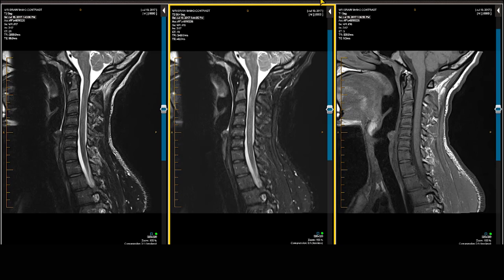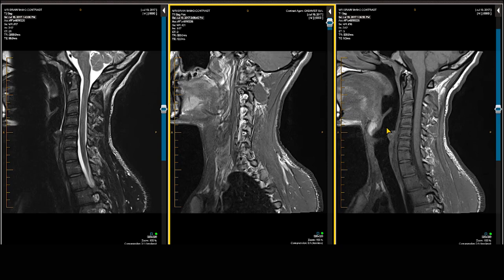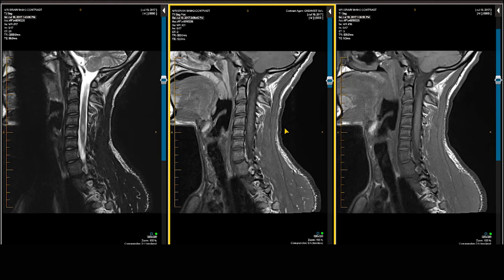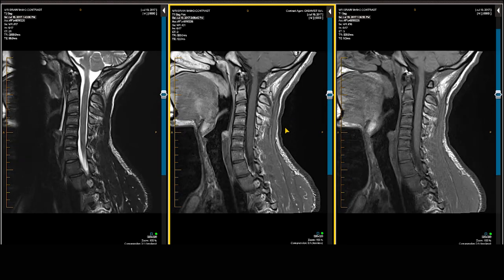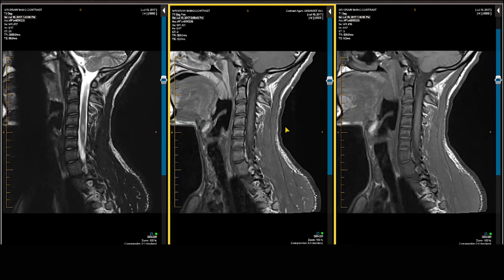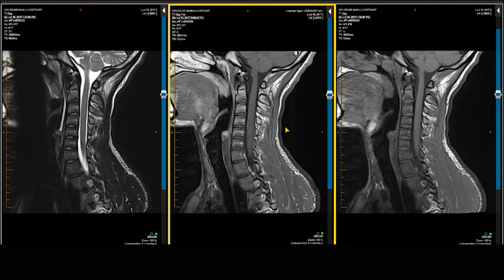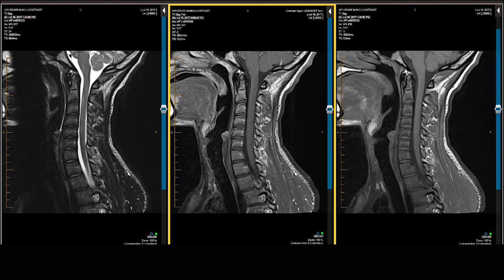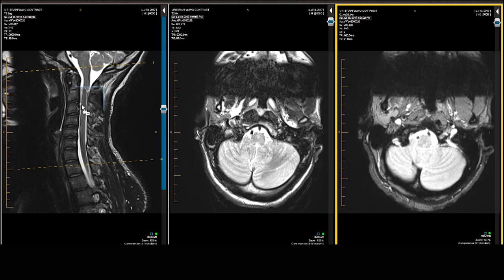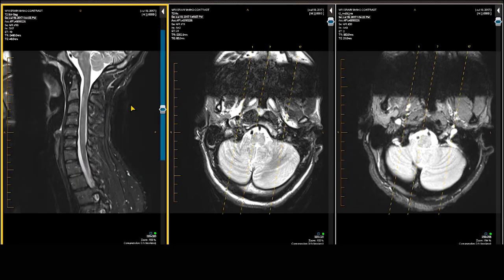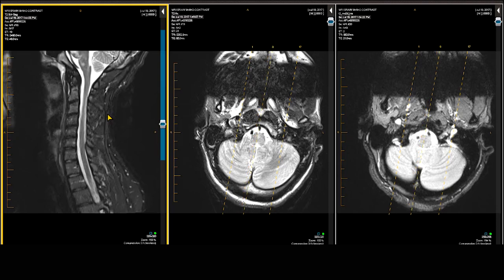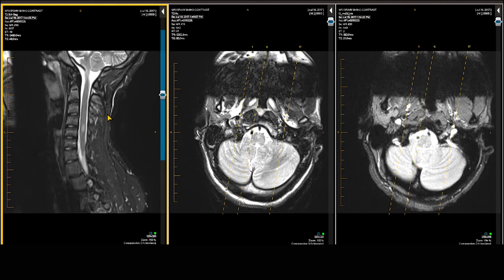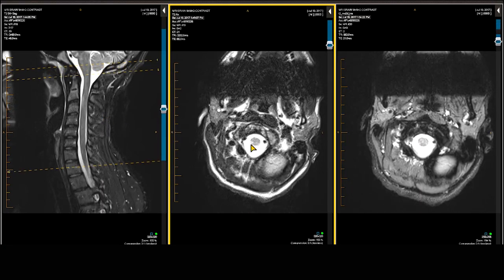Bringing down the sagittal post-gadolinium enhanced scan and comparing it to the pre-gadolinium scan, we are able to define whether these plaques show contrast enhancement. When looking at the axial scans, I usually have either the T2-weighted scan or the STIR image available in the sagittal plane as I scroll through the axials.